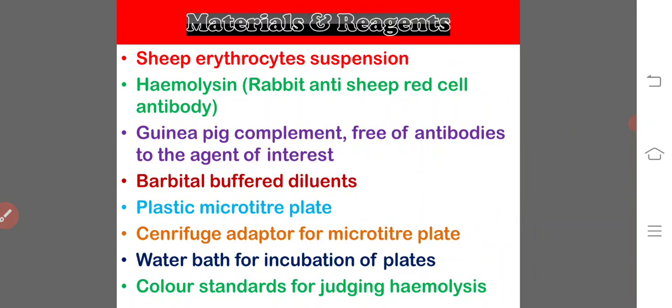During pre-incubation of that fixed amount of complement with an antigen antibody system that is not related to SRBC and anti-SRBC, complement attaches to the antibody in this antigen antibody complex. This attachment or fixation of complement results in the activation of the complement cascade and the consumption of the complement components by the antigen antibody complexes.